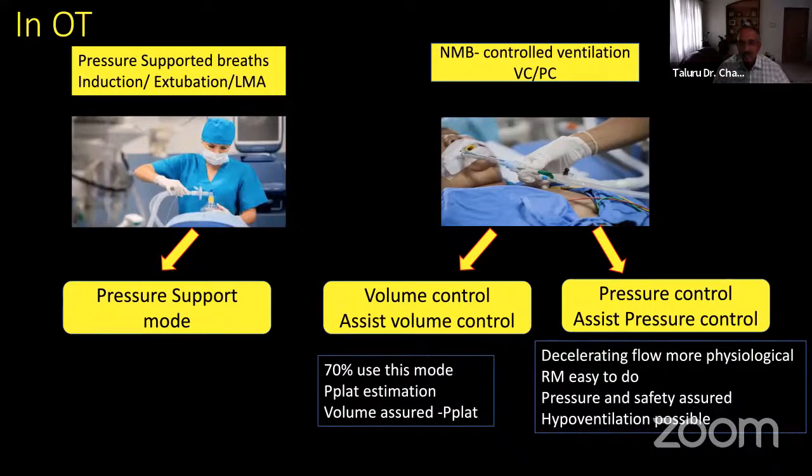When we speak of volume or pressure, the younger postgraduates get confused about what they are setting. If there is pressure, is there no volume? Or if there is a volume, is there no pressure? That understanding is the first step in understanding the modes. In the next 2-3 slides, I'll make it very clear what it means for you when a volume is set or a pressure is set.